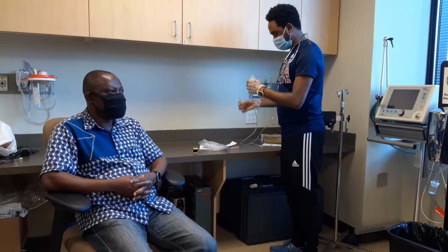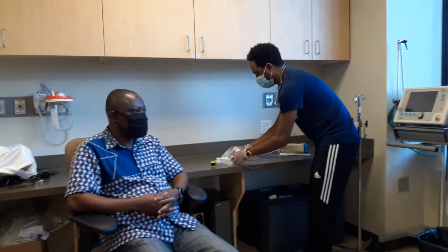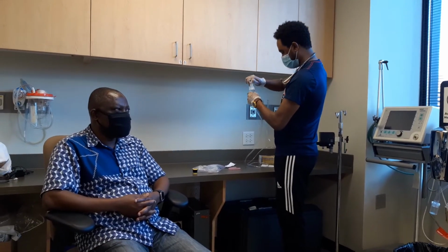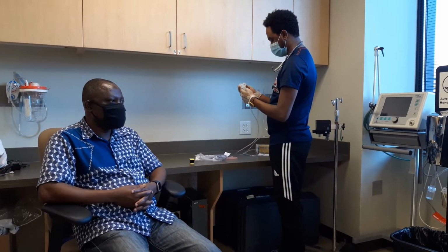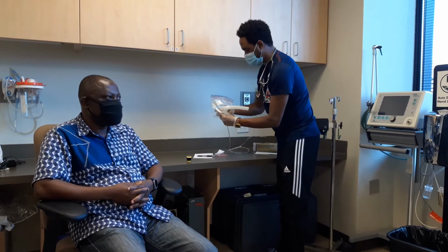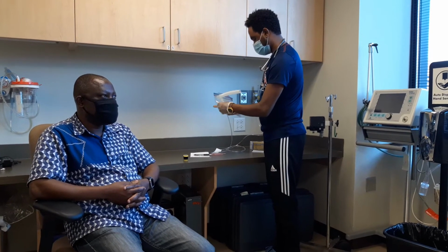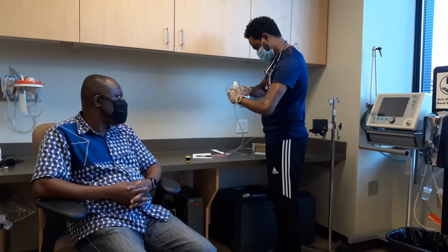I put both of the medications. I'm going to close the cap, the T cap, the pipe. I'm now going to tighten the mouthpiece and hook it like this.